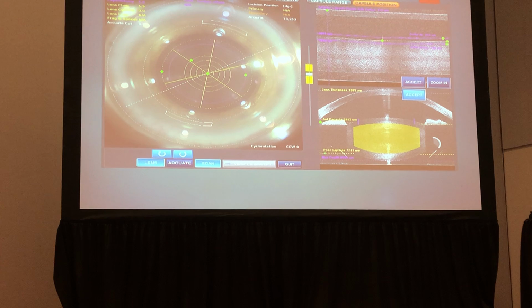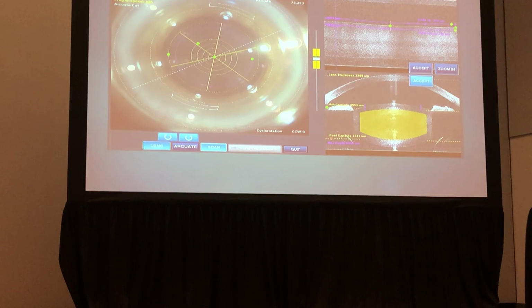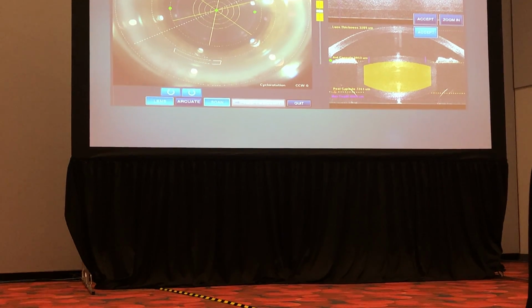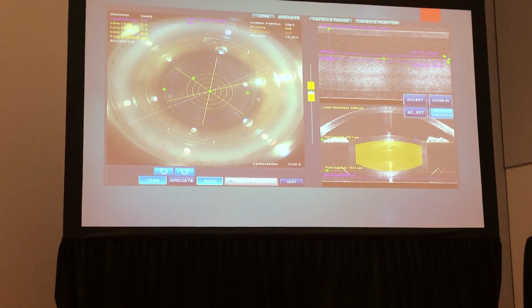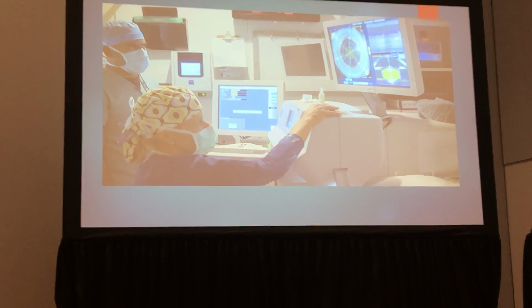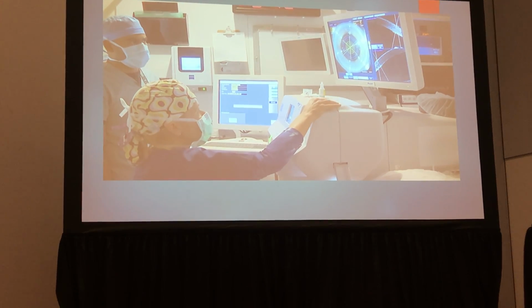So this is one way for you to adjust. I can adjust this a little bit, but I'm actually pretty happy where that is right now. It does give you an 800 micron posterior safety zone, but I'm happy with my lens fragmentation, so we're going to go ahead and accept that. It's going to show me my arcuate incisions. We do have 2 arcuate incisions for this patient. She has about 1.25 diopters of astigmatism, so let's move on and look at that.